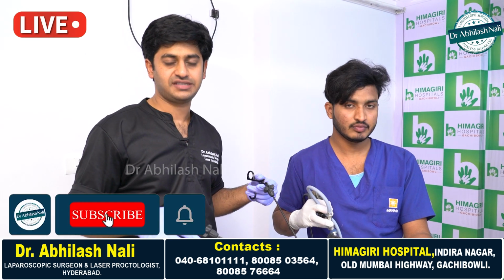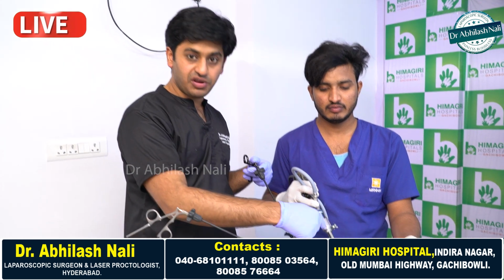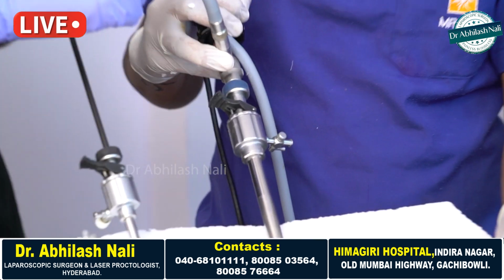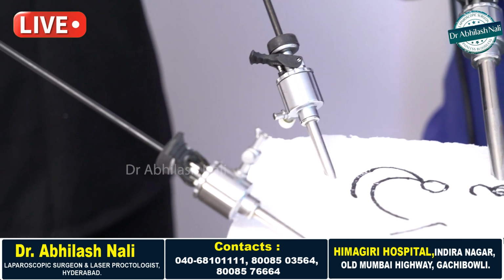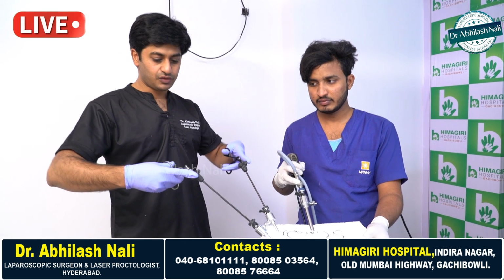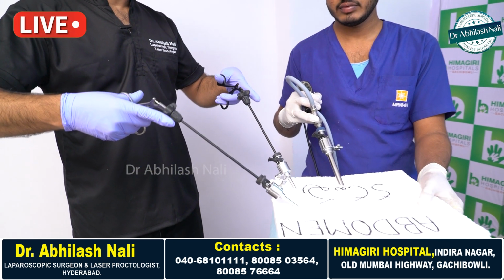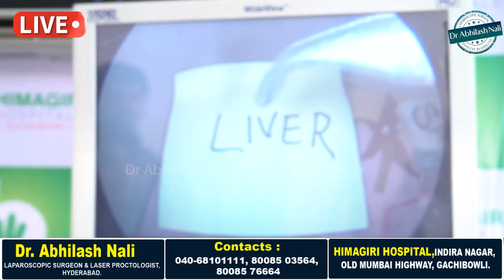So in laparoscopy surgery, generally we minimum require 3 ports. One port will be for the camera. Through this camera we'll be able to connect to the monitor, and the remaining 2 will be the working ports. These are the right and left hands of the surgeon, and these instruments will be guided by the camera.